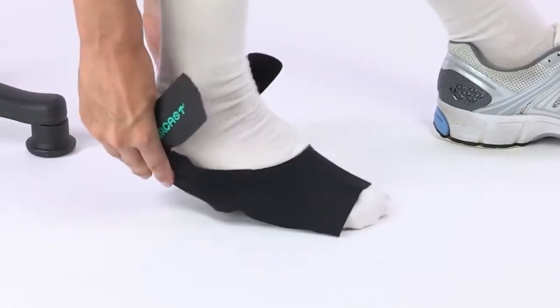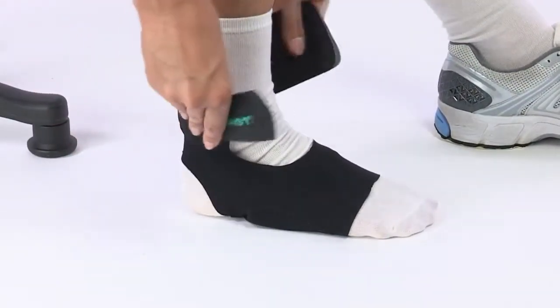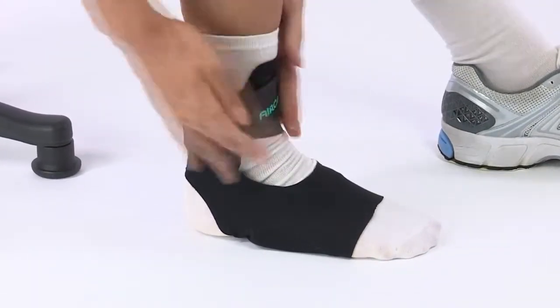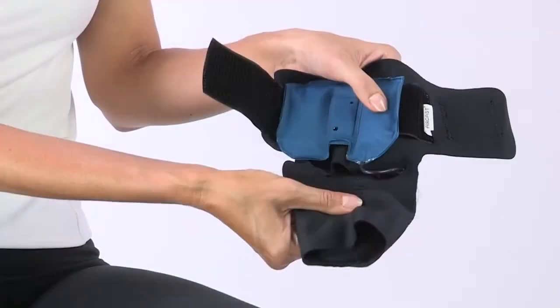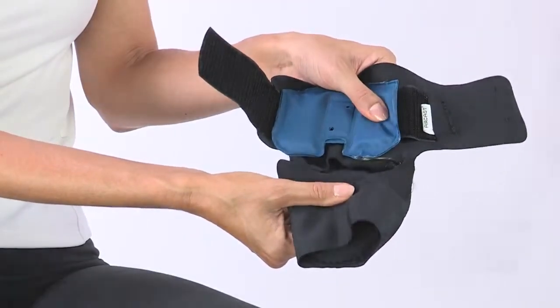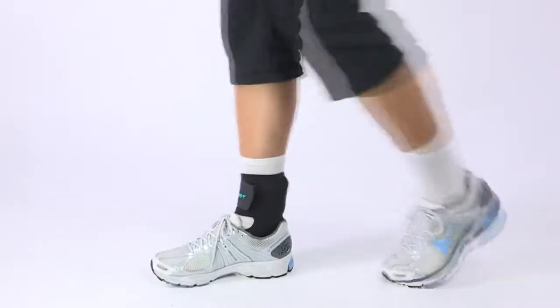The AirCast AirHeel is simple to use. Just slip it on like a sock, toes first, until your heel slides into the opening. Adjust as needed and fasten the Velcro strap around your ankle like this. Be sure that the air cells are positioned under your arch and behind your Achilles tendon. It should be comfortably snug, not tight.